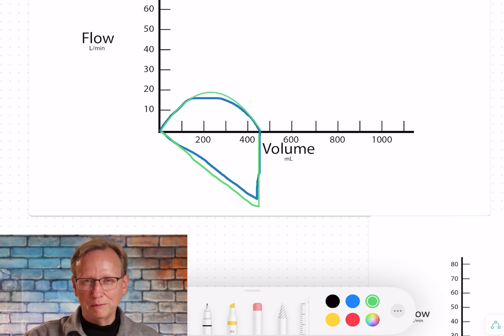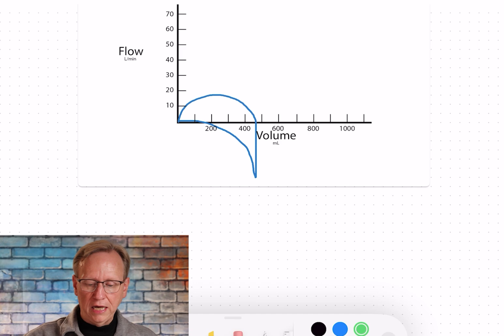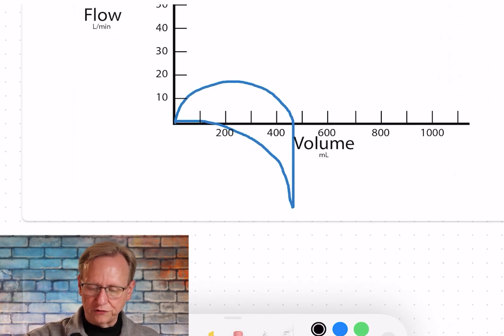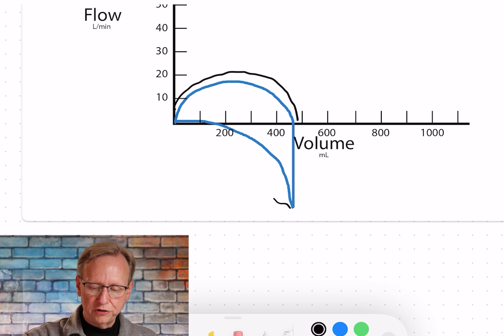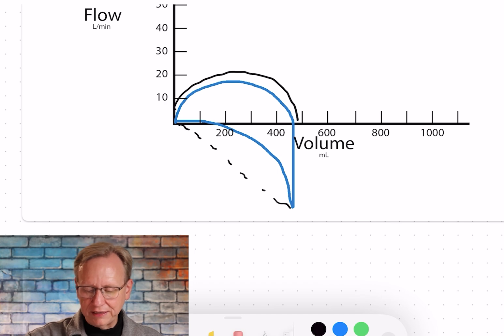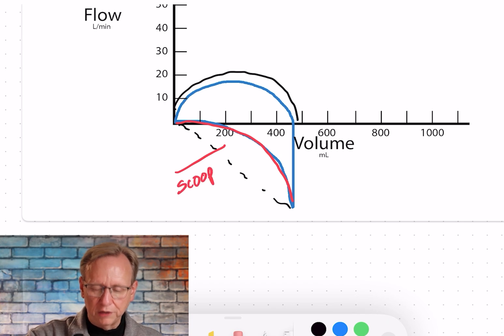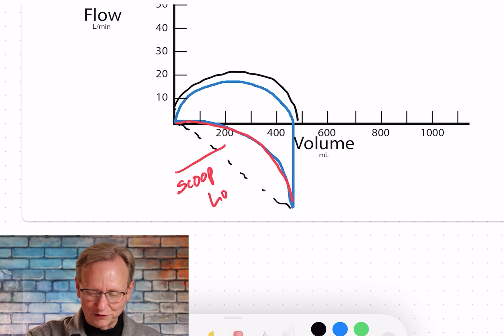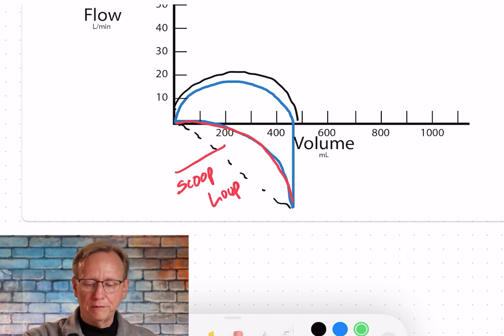Now let's look at a loop that's a little messed up. The first part of this loop is normal as it goes up, but the second part — which should show a straight line directly to zero — doesn't. Instead, you see this little scoop right here. This is what we call a scoop in the loop, and that's a good way to remember it. If somebody is having trouble breathing out for any reason, that's called an obstruction. A COPD patient would demonstrate a scoop in their loop.